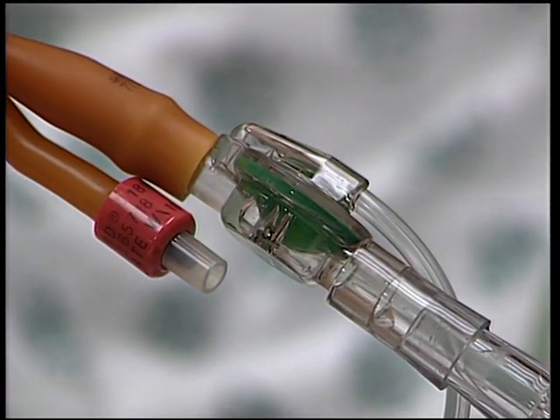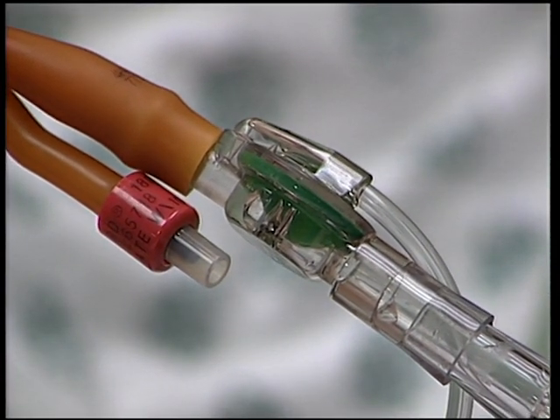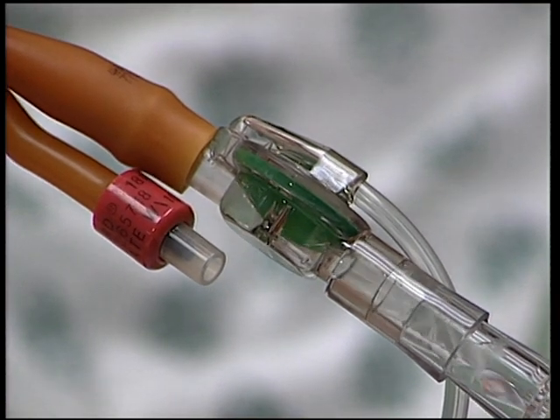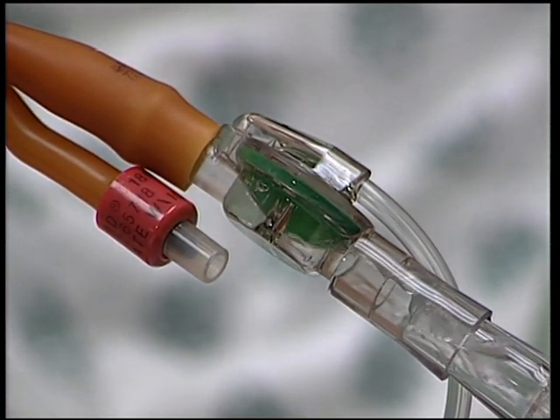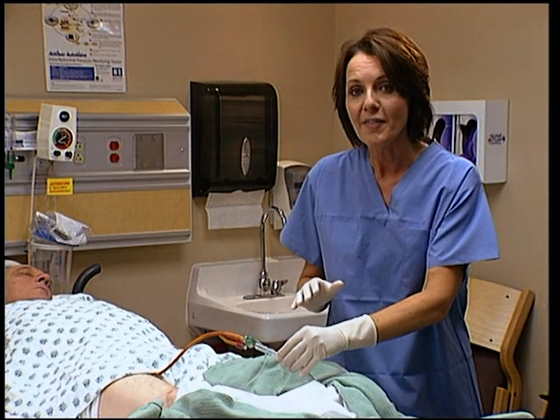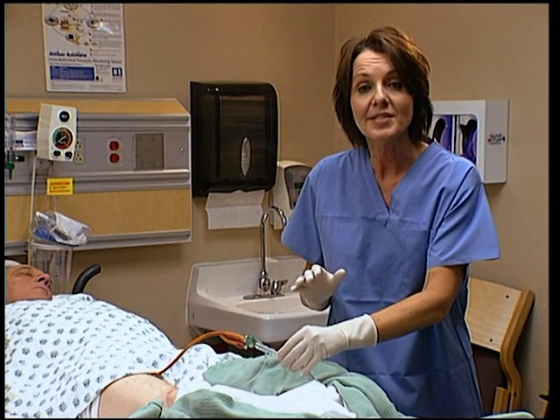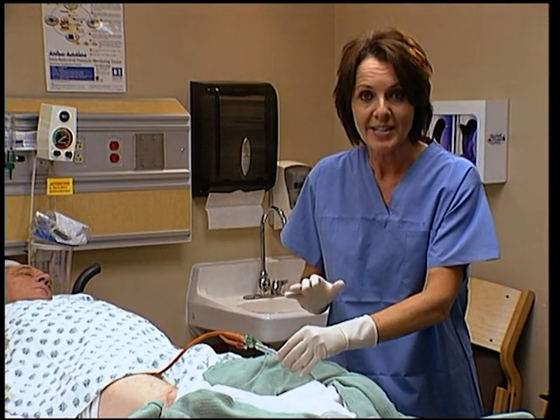After approximately two minutes, the diaphragm collapses and the valve automatically opens, allowing the injected saline to drain into the drain bag. The valve remains in this drain position until you infuse saline to obtain your next trending data point.